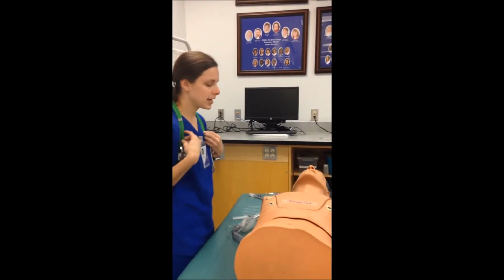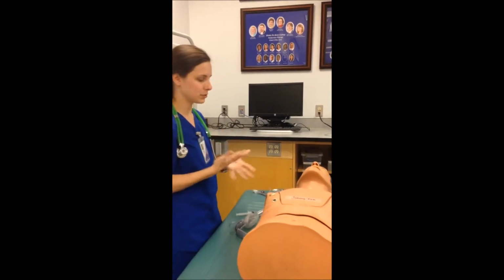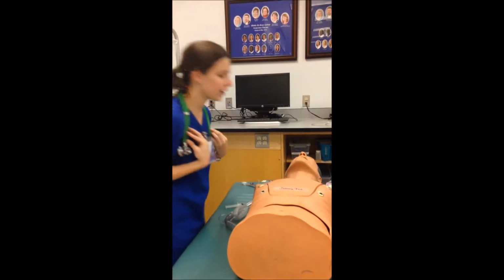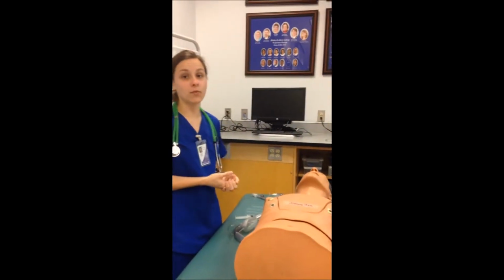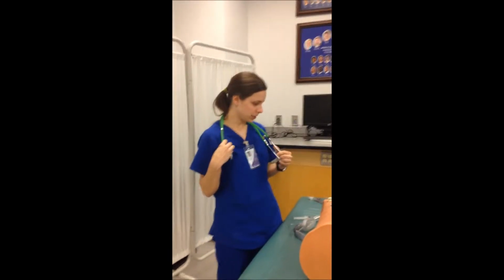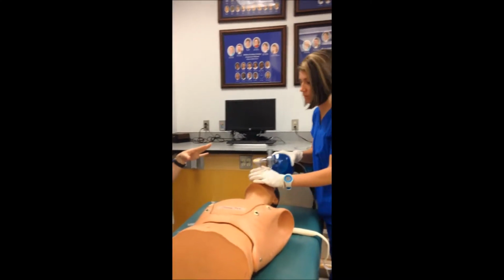Thank you. I'm just going to ask you a few questions to assess how easy this procedure is going to be. Can you open your mouth for me? Okay, this patient seems to be a Mallampati of 1, which means the procedure should flow easily. No facial hair is noted, which also eases my procedure. I'm going to step out of the room to wash my hands. Becky is my assistant. She's going to ventilate my patient to 100% oxygen before we get started.